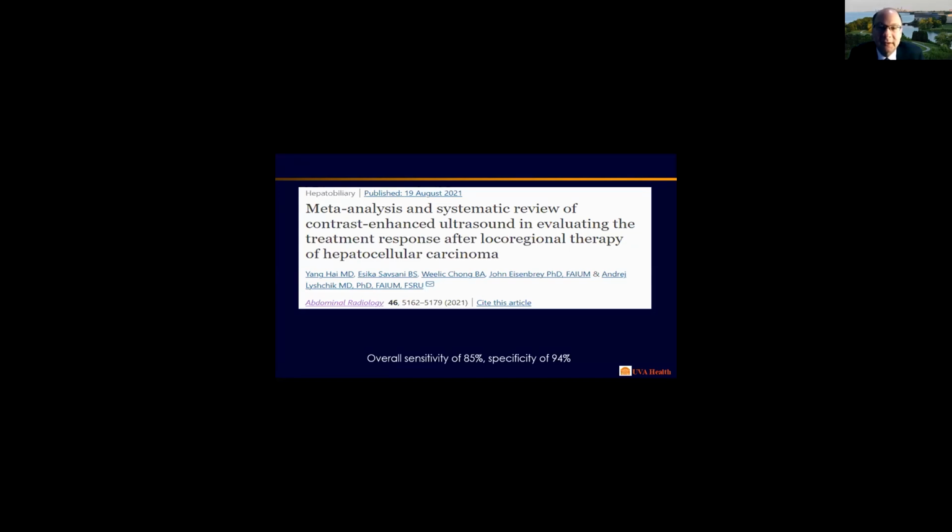And I think it does play a role, as mentioned. I know we certainly have a lot of interest at Northwestern. Helena Gabriel is leading our contrast enhanced ultrasound. We're using it more and more. I do wonder, you did show a nodule of enhancement. Is ultrasound going to have the same challenges following radioembolization as MR? If you do see nodular enhancement, I think it'll be interesting, but they probably shouldn't necessarily call it tumor following radioembolization either. So it'll be interesting to actually write about those kinds of findings after radioembolization as well.